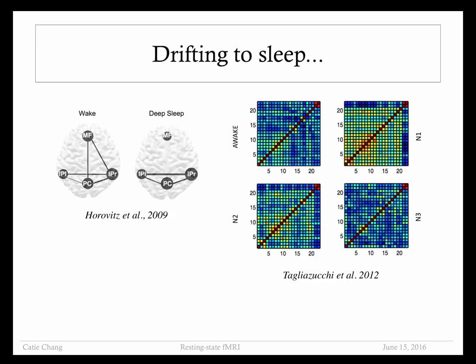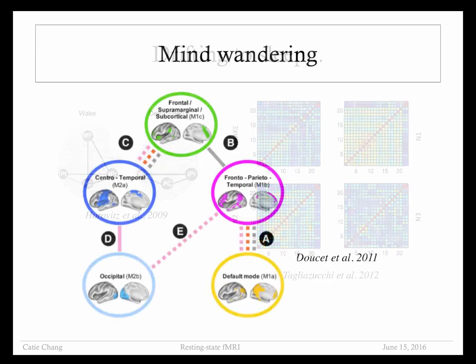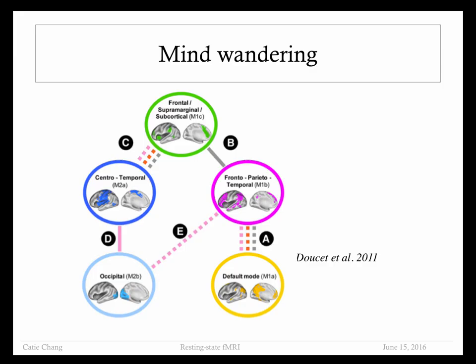But if we look at this from a more positive viewpoint, the fact that we can see these neural state changes reflected in our resting state signals also means that we can use that data as a way of maybe studying what kind of correlates are going on in the spontaneous activity of these natural changes, which is something we couldn't analyze with task data quite like that.